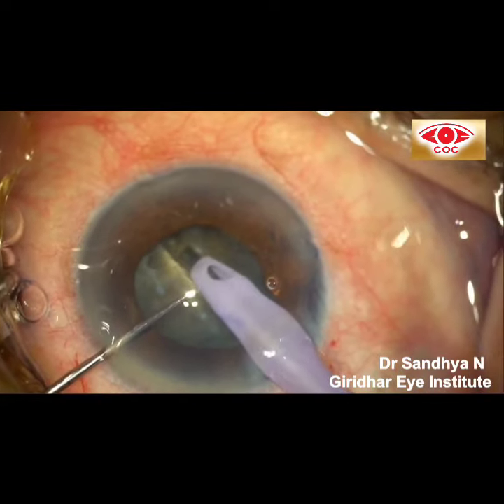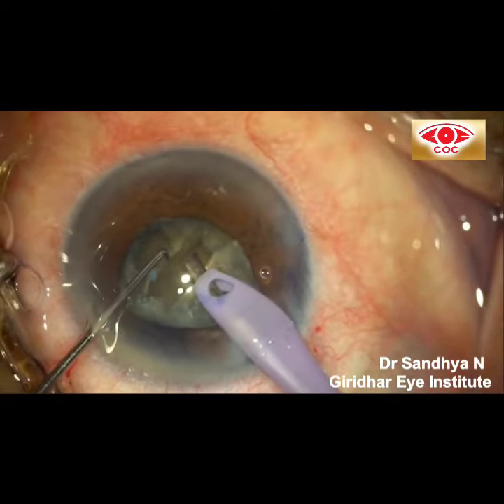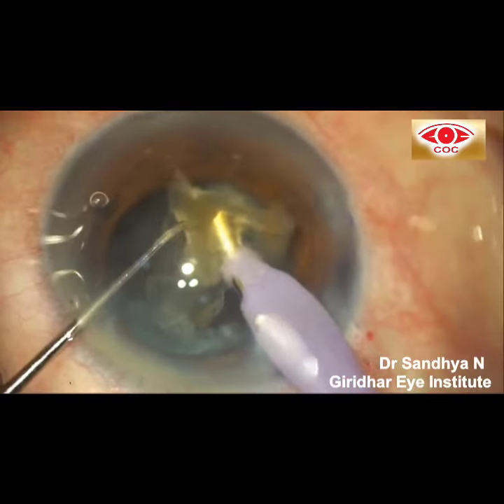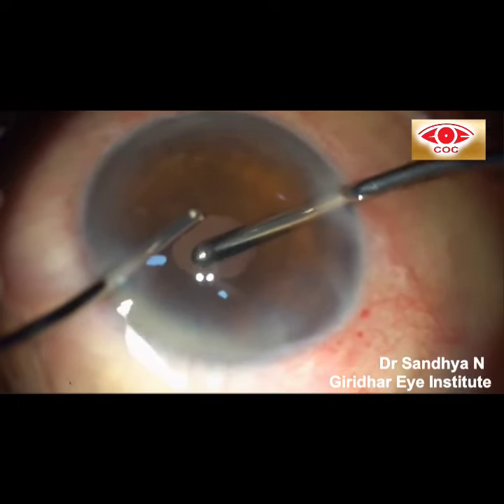This was another patient on tamsulosin. There was anterior chamber turbulence and iris fluttering during surgery. Once the phaco parameters were reduced, the anterior chamber became stable throughout and I could complete the surgery safely. We can use pupil expansion devices in case of poor pupil dilatation.